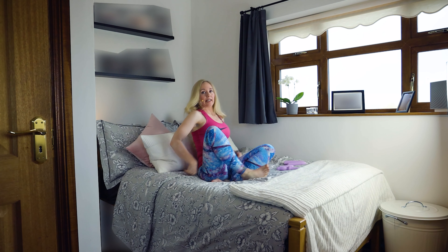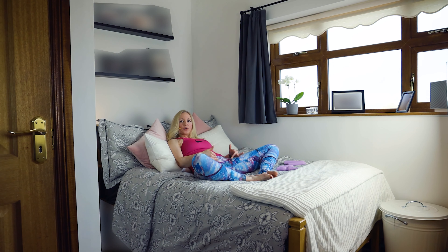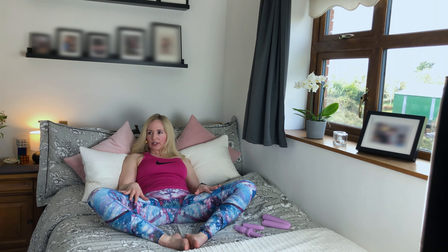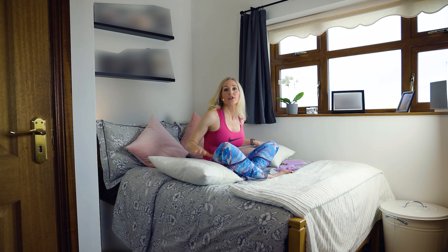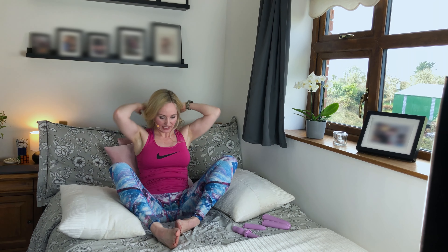I'm just going to lay back here on the bed. One of the first things is the position you'll take — you can just lie like this. You can see my knees are quite close to the sides of the bed. The adductor muscles on the insides of the legs connect through connective tissue directly into the pelvic floor. If the legs don't actually relax when you come into this position, it's much more difficult to allow the pelvic floor to relax. So you can take two pillows and put them either side, and then really allow the legs to relax. You can also put more pillows behind your back to be a little more upright.